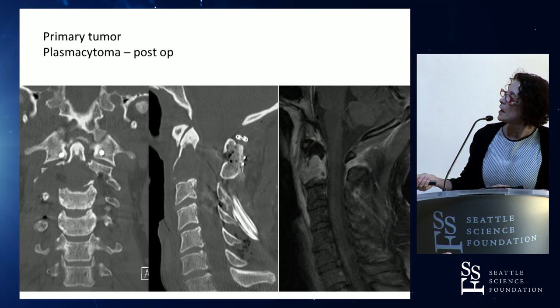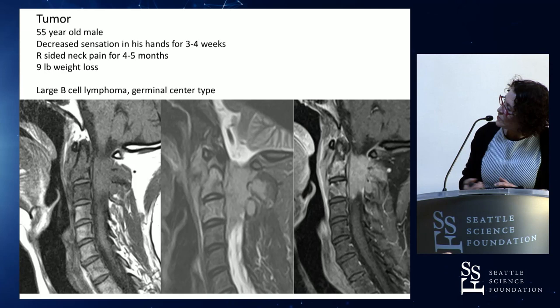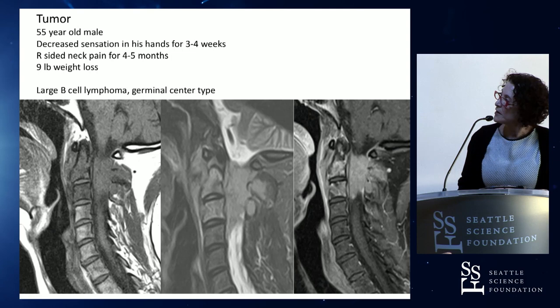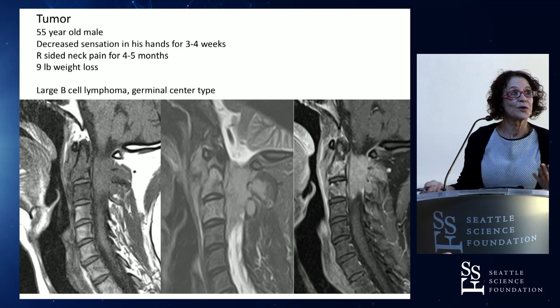Here's another gentleman who came in with decreased sensation in his hands for a few weeks, some neck pain, some weight loss - sounds like a standard cancer presentation. This turns out to be a B-cell lymphoma. The only difference from the other masses is there's maybe a little more bone involvement. The take-home remains: you need both CT and MR, and we're not going to be really good at differentials.